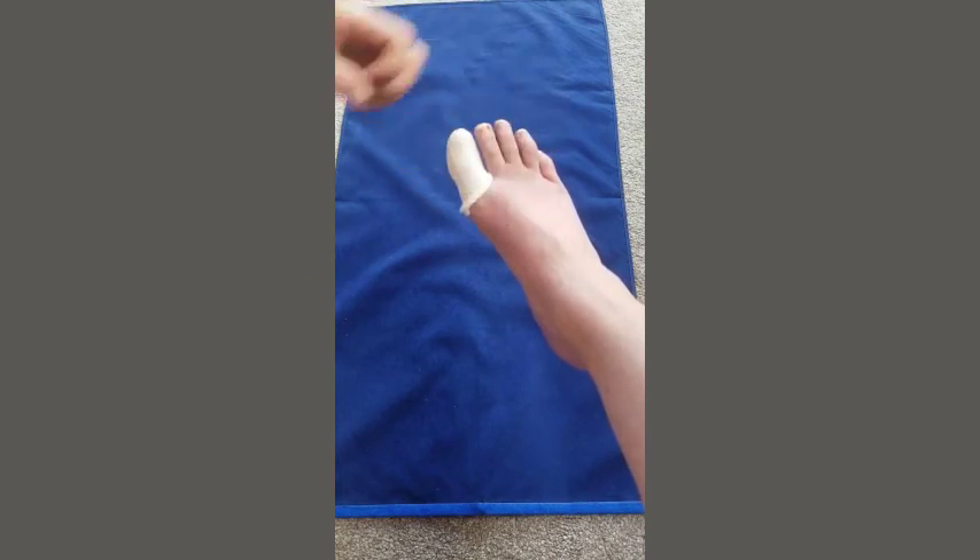A bit of tape at the bottom will secure it in place. This is a very good applicator to use to help apply tubular bandage when you're dressing a toe.